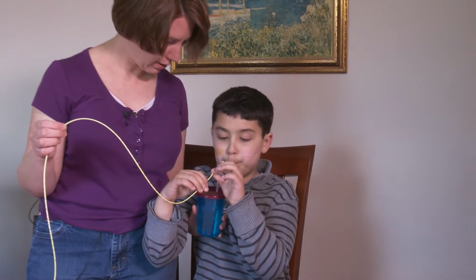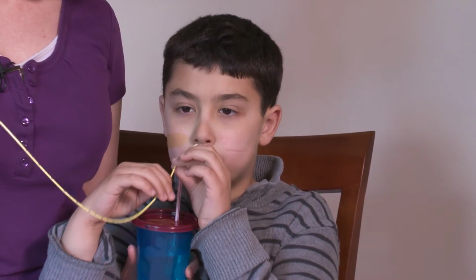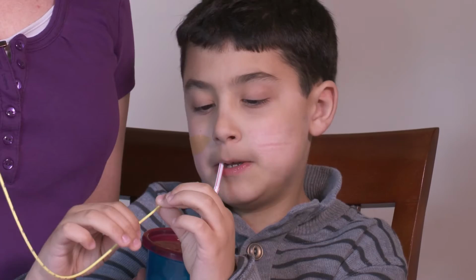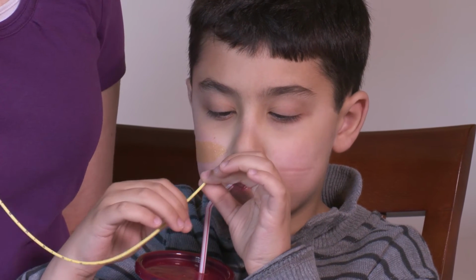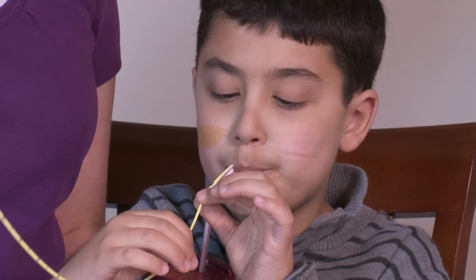Okay, ready? Okay. Ready? 1, 2, 3, go. Oops. Oh, it's a fail. It's okay. Don't drink all the water before you do this. Yeah, that's right. Don't put it in your mouth by accident or your eye either, right? Okay, go ahead. Right, so you're aiming for your ear, remember?